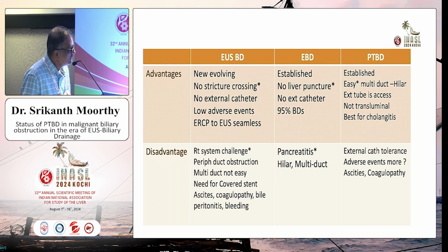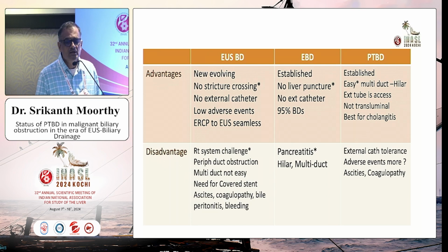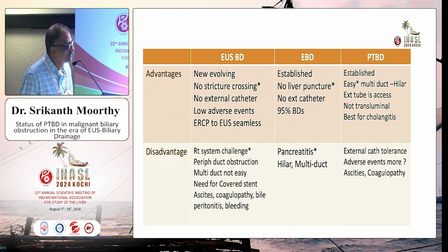And another advantage here, we are not translumenal. We are not going from the lumen with infection into the duct. So there is a theoretical advantage here. And we have to admit it, when you have a frank cholangitis, this is the only technique that gets the bile out of the liver quickly within a day.